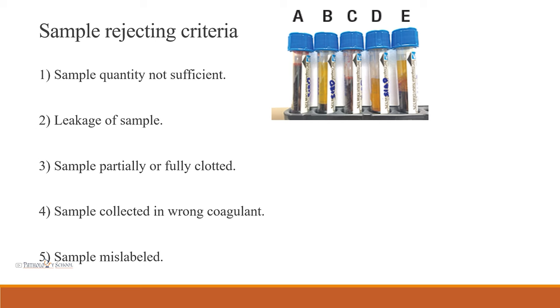There are various criteria for sample rejection. First, if the sample quality or quantity is not sufficient. Second, if there is leakage — if the container is soiled with blood, the sample can be rejected. Third, when the sample is partially or fully clotted, it cannot be run on the hematology analyzer. Fourth, if the sample is collected in the wrong anticoagulant it can be rejected. Finally, if the sample is mislabeled, it also has to be rejected.